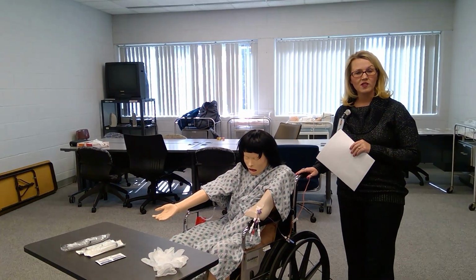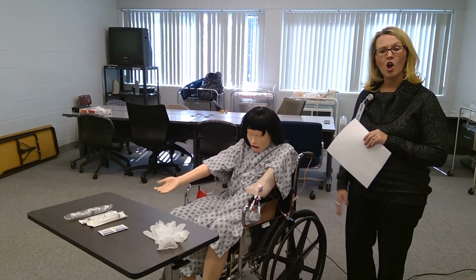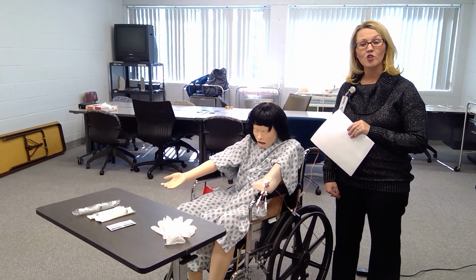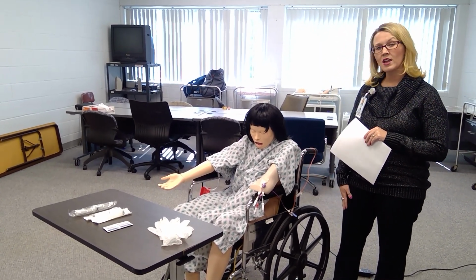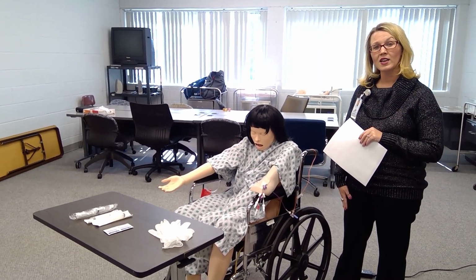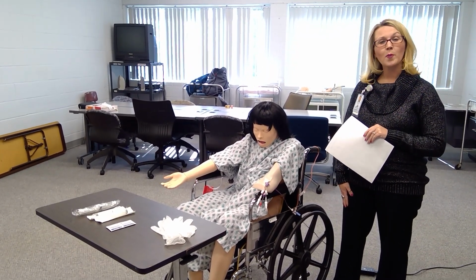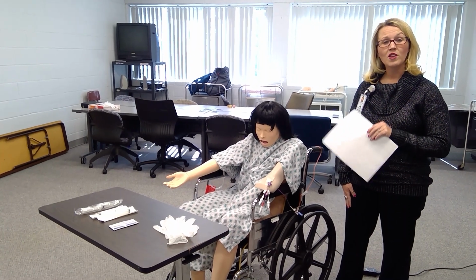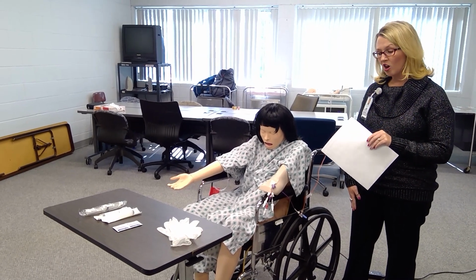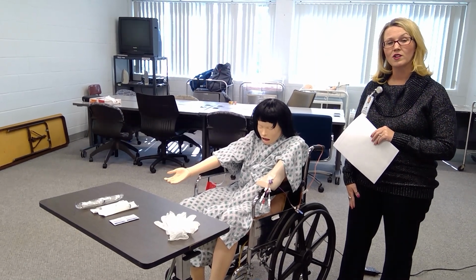So today Sarah Lynn is with us because she has a PICC line in place, and Sarah's going to be going home with this PICC line because she developed a surgical site infection after her appendectomy, and she's going to be on an antibiotic regimen for about 4 weeks. So what we're going to do today is focus on how to pull a blood sample from her PICC line, and then we're going to show you a proper technique for how to change the dressing. You'll hear us talking to Sarah, and then Sarah will also be interacting with the nurse who is providing care for her.